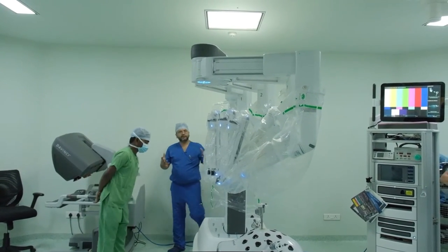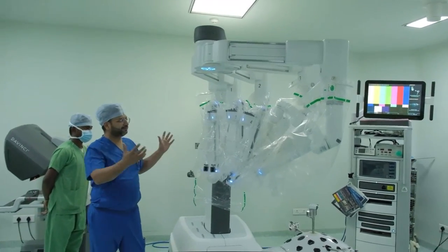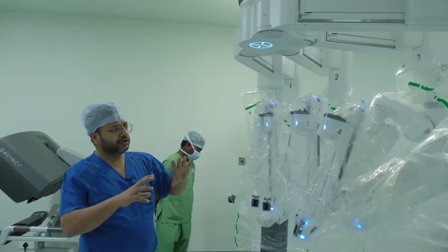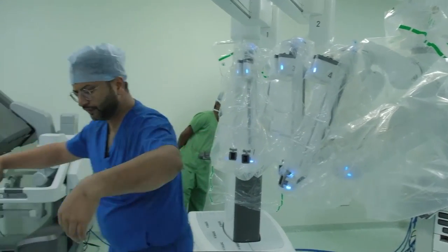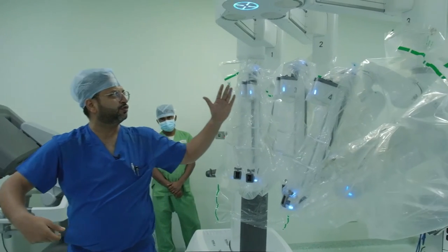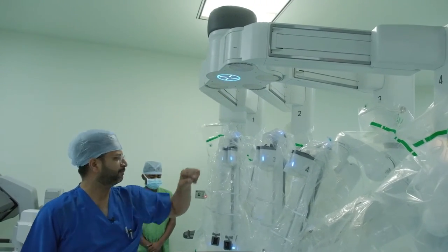You can see the entire XI boom has gotten up and how it has expanded with all the forearms, and it has taken its position based on the pelvic anatomy. So this side is the pelvis, so the robot operates towards itself. So it has taken a position, it is going to operate towards itself. So this is how the boom has rotated. Now it wants us to take this target point.